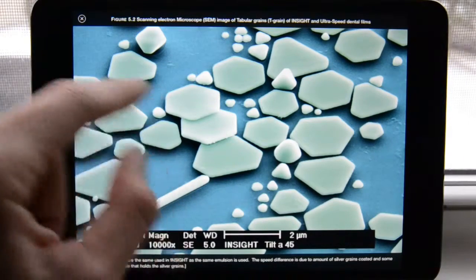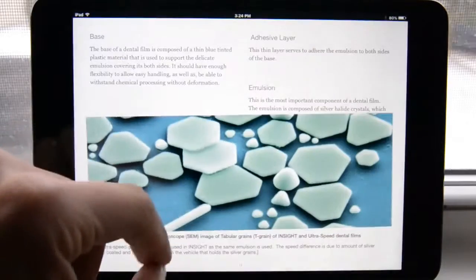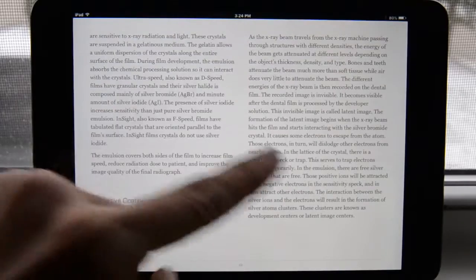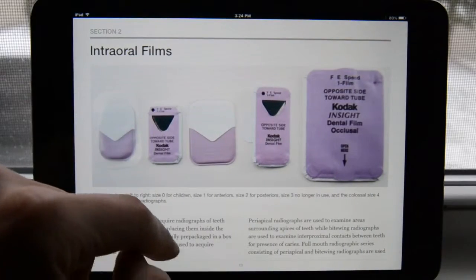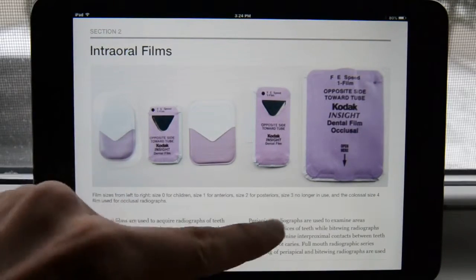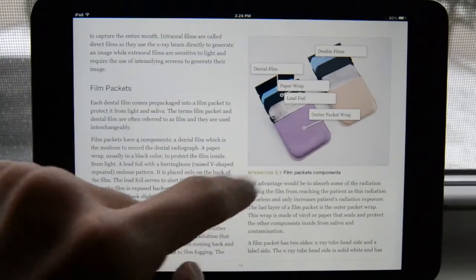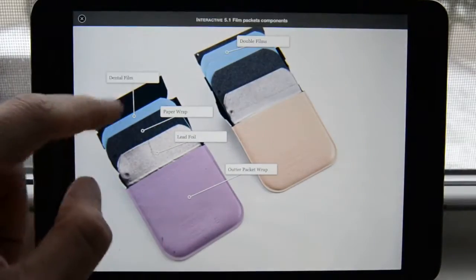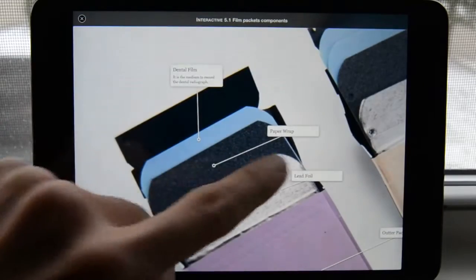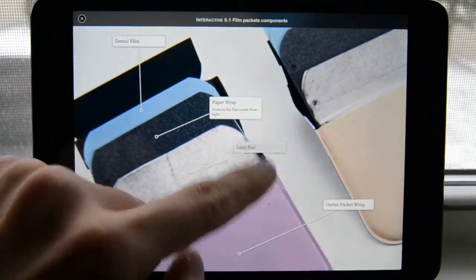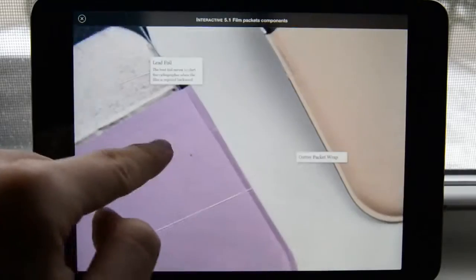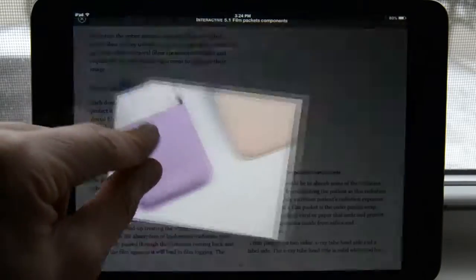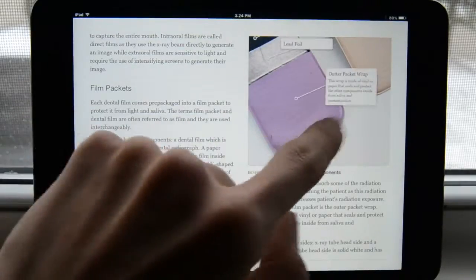This is a scanning electron microscope image of the silver halide crystals, colored in Photoshop showing the tabular crystals — this is from Carestream Dental. Then we keep moving forward and we see different types of intraoral films. Bringing this to full screen I can see the components of a dental film packet: the paper wrap, lead foil, and outer packet wrap.